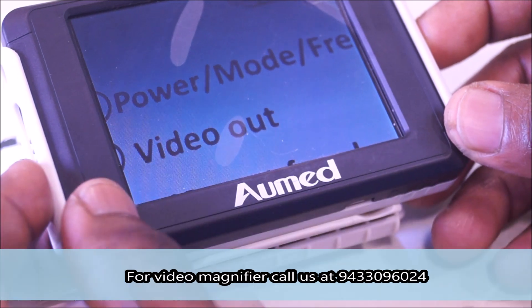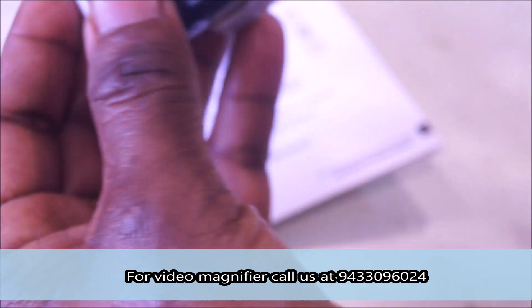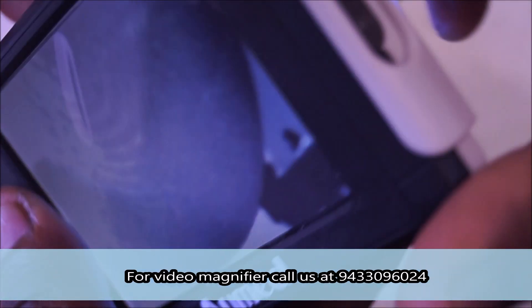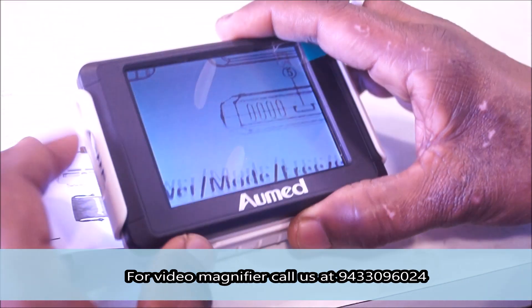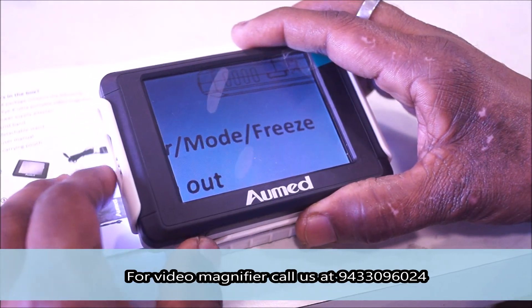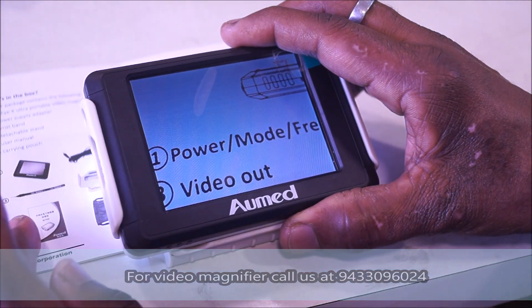The doctor confirms there is no right side switch visible and asks the patient again how to increase magnification — the patient identifies the right side. To reduce magnification, the patient confirms it is the left side. The patient is now able to read using the device with the power and mode settings, and the session is concluded.